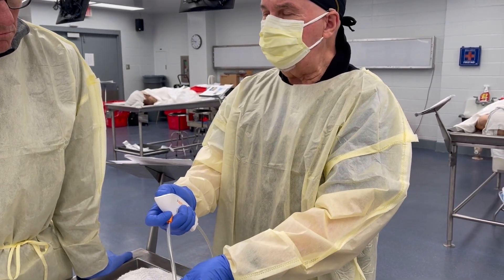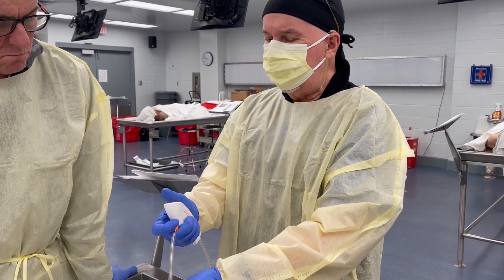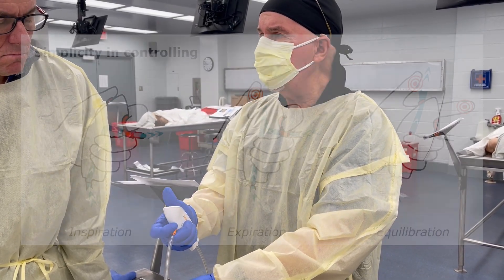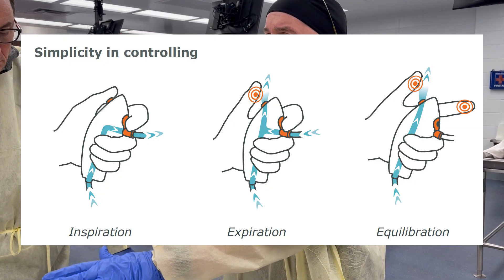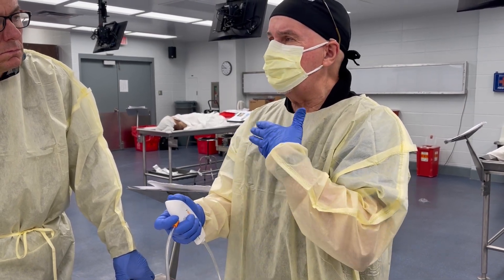You can lift your thumb — think about thumb suckers, little kids. Thumb sucking pulls the air out. So if you have complete airway obstruction, this actually lets you remove the air from the chest rather than just put air in and pray that it goes somewhere when you have complete airway obstruction.